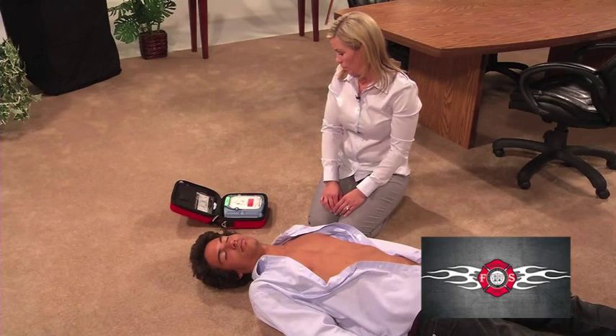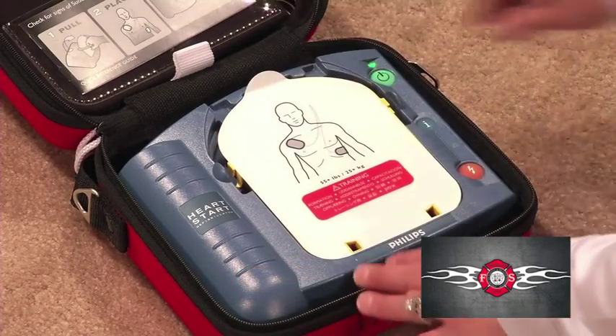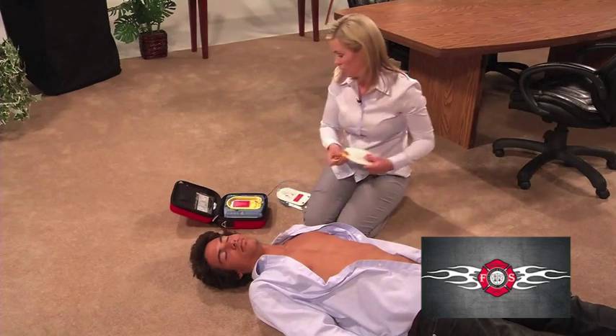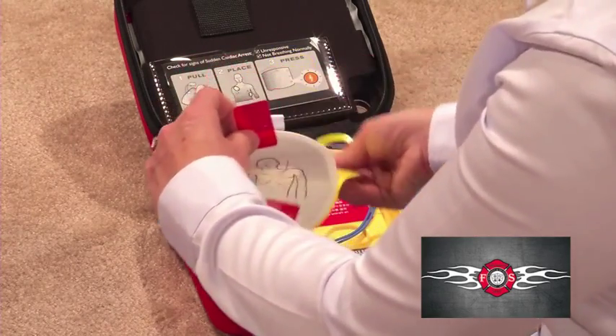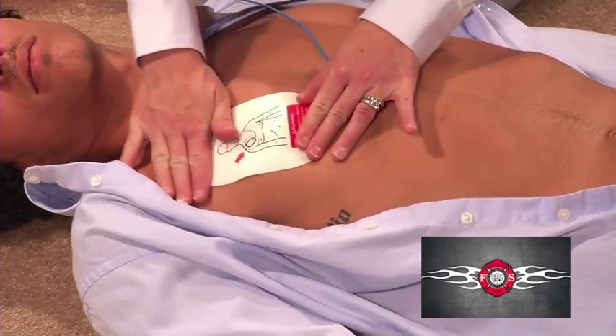When the patient's chest is bare, remove the protective cover and take out the white adhesive pads — these are the electrode pads. Look carefully at the pictures on the white adhesive pads and place each pad exactly as shown in the picture.